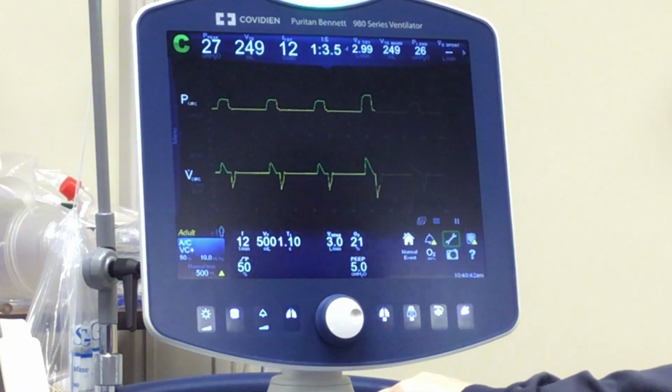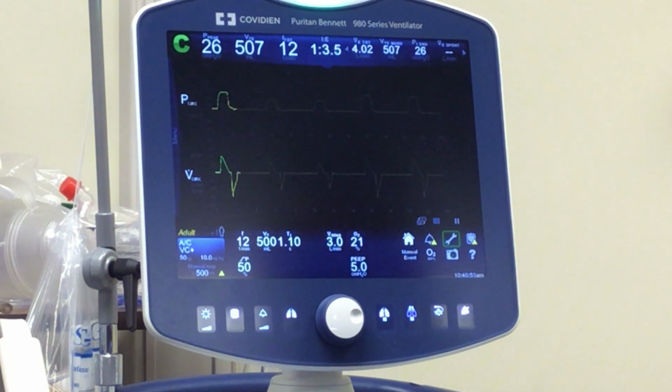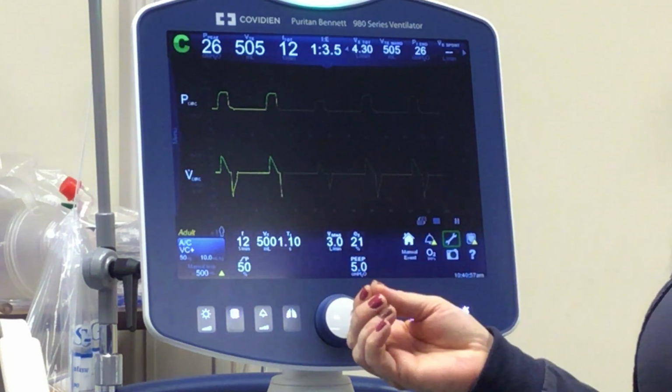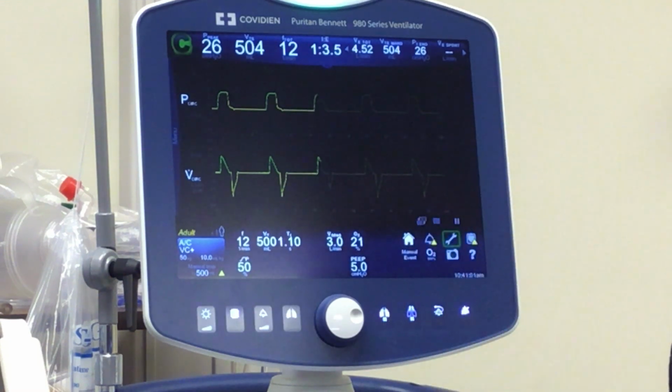All right. So if I adjusted the tidal volume, why would I need to adjust that based on the blood gas? If you need the patient to breathe in deeper because they have a higher carbon dioxide, if their CO2 is up, you want them to take a deeper breath to be able to exhale more. Excellent. Good. What other setting can we adjust to blow off CO2?